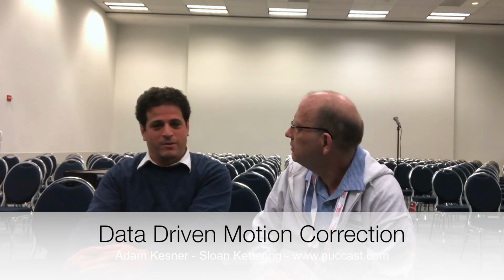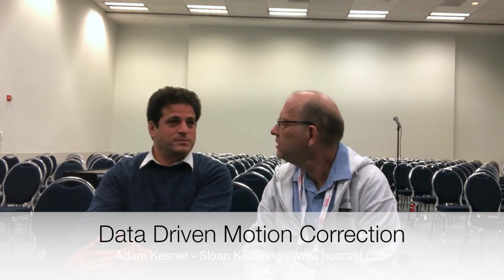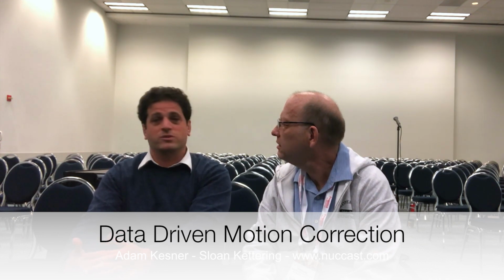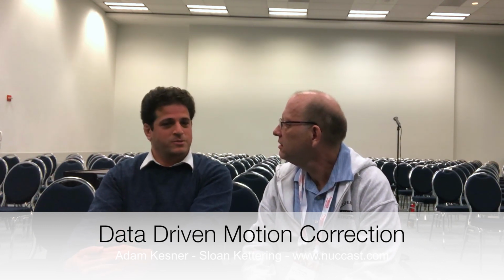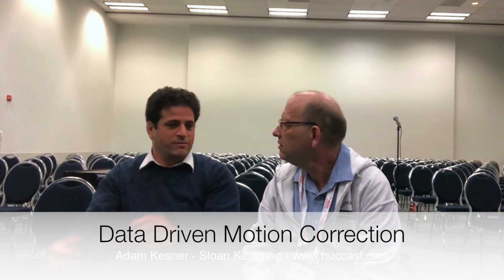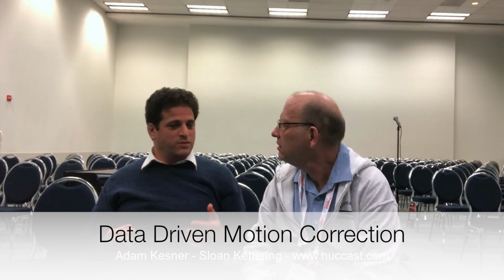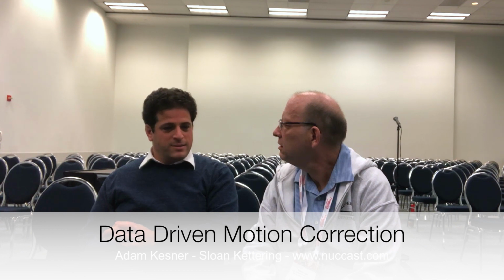That's right. Motion is an inherent problem in, I would say, all medical imaging modalities, but in particular, PET is particularly susceptible to patient motion because PET scans are acquired over the course of minutes. Yes. And patients necessarily breathe, their heart beats, and sometimes the patient adjusts themselves to get comfortable, or coughs. Yeah. So you get bulk motion shifts.